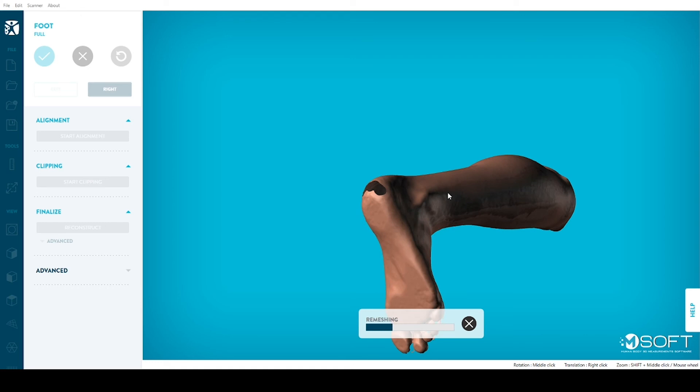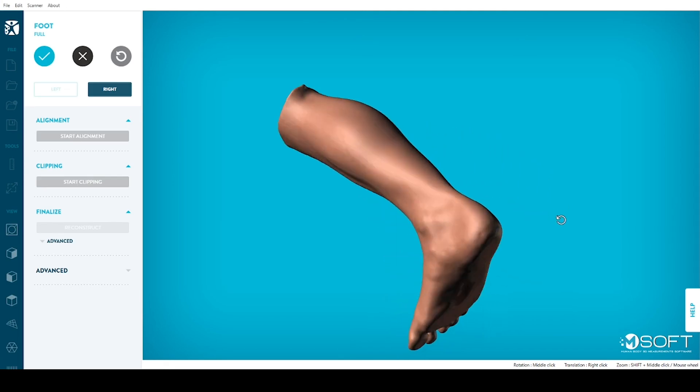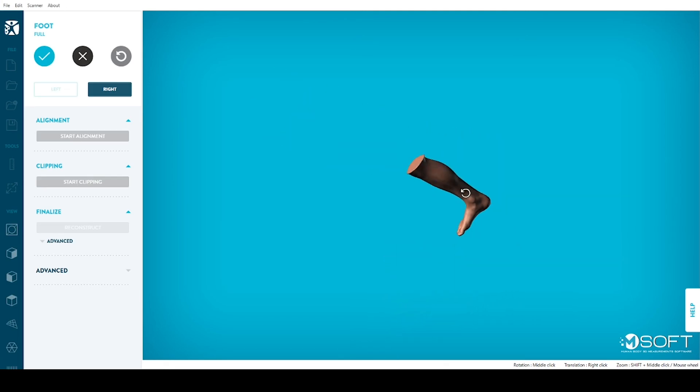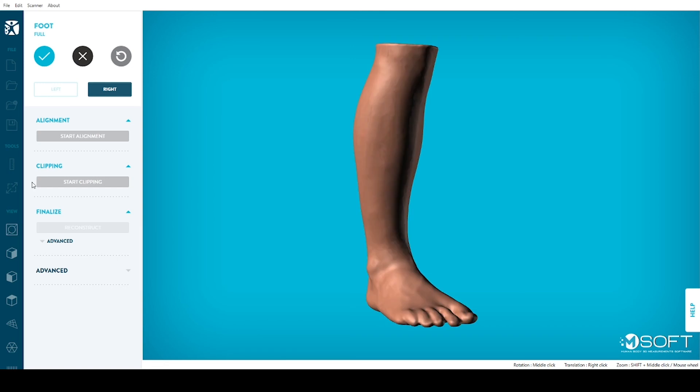M-Soft will do the work for you in only a couple of seconds. Click on the blue checkmark.